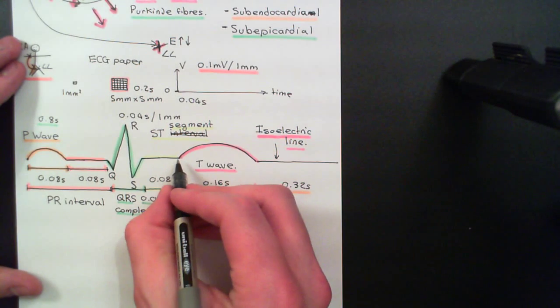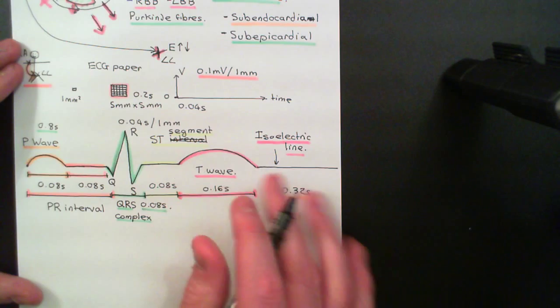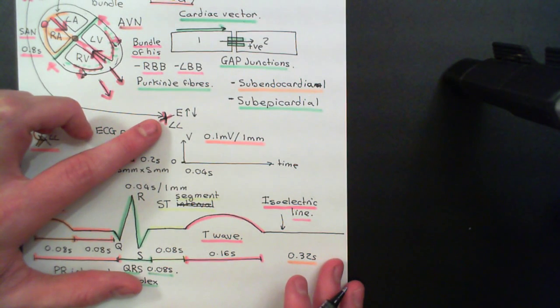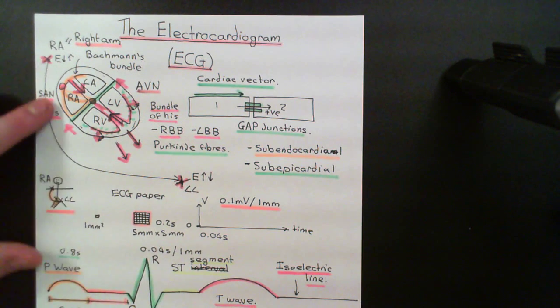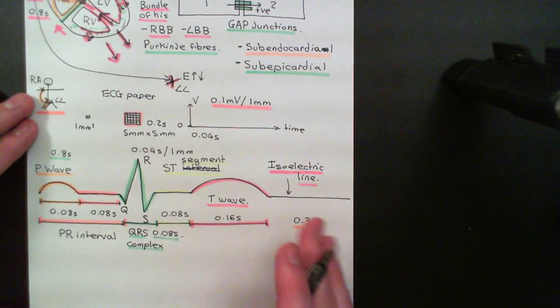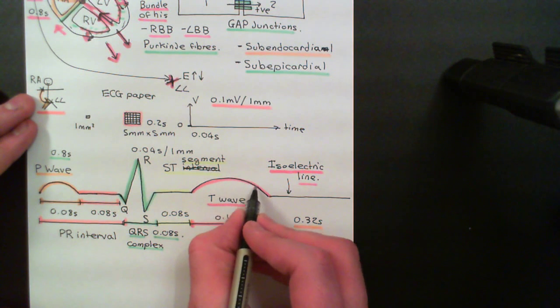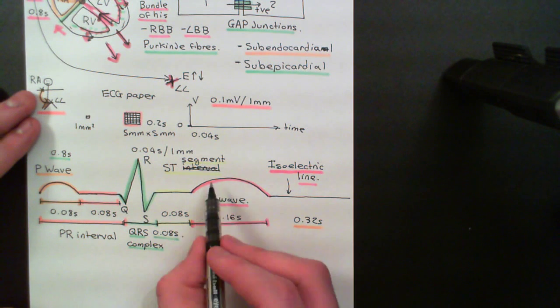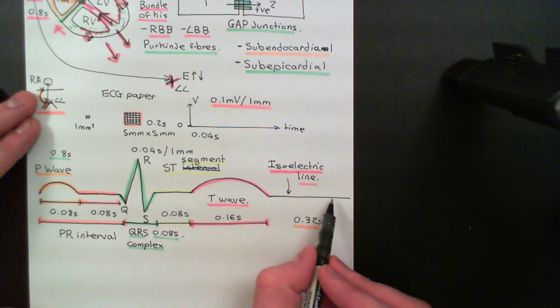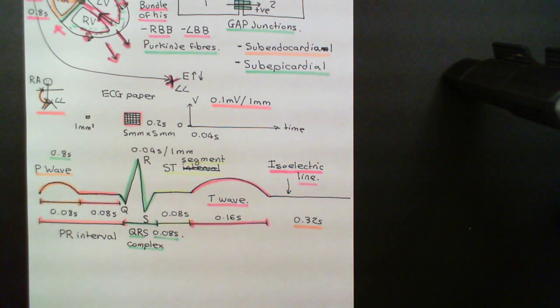Okay, and hence again we're going to get an upward deflection in our ECG trace here, because the electrical potential is going to be rising down at the left leg and lowering up at the right arm rather. Okay, and therefore we will get a positive electrical potential difference between the two, so this will deflect up now. And then of course, as quickly as it was produced, it will then be destroyed by extracellular currents reversing it. So we'll come back down, and then that's the end of the cardiac cycle, so we're then back to electrical neutrality between the two. We're back to the isoelectric line here.